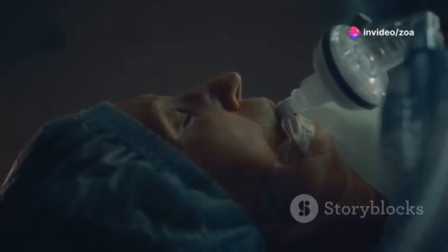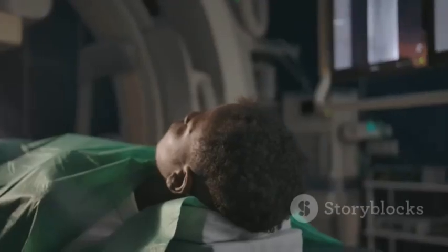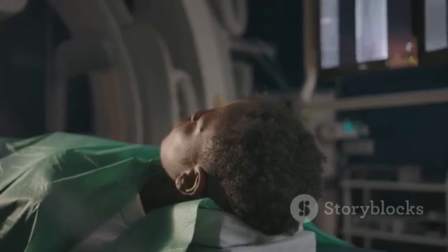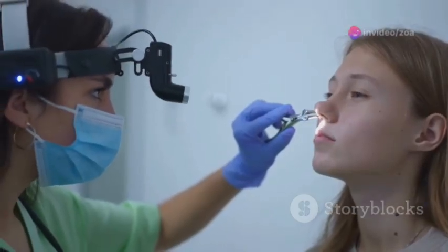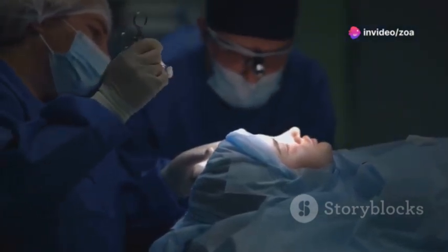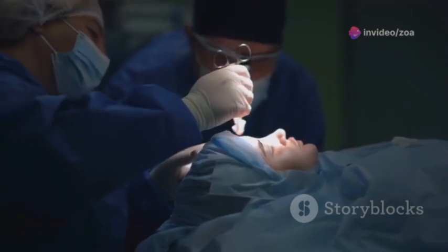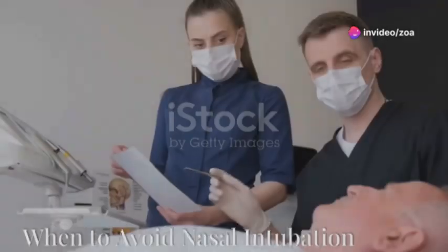Furthermore, nasal intubation is often preferred for long-term ventilation. It offers increased patient comfort compared to oral intubation, as it avoids pressure on the tongue and oral mucosa. Other indications include procedures requiring an unobstructed oral cavity, such as maxillofacial surgeries, and situations where patient cooperation is anticipated, such as during awake fiber optic intubation.